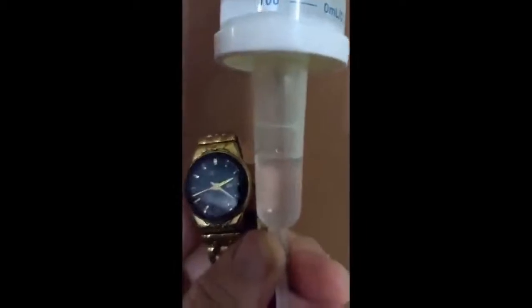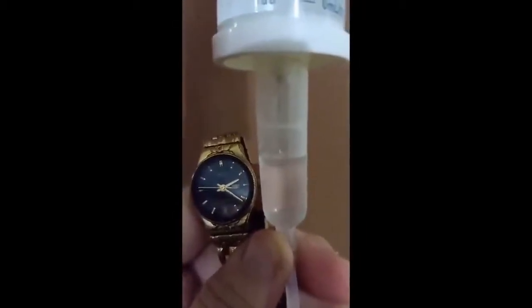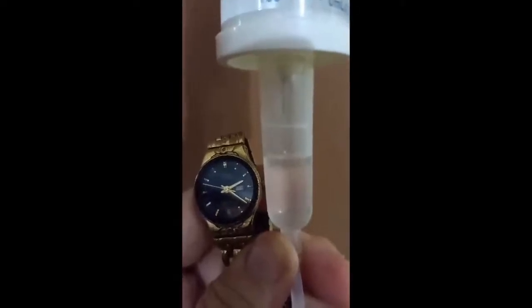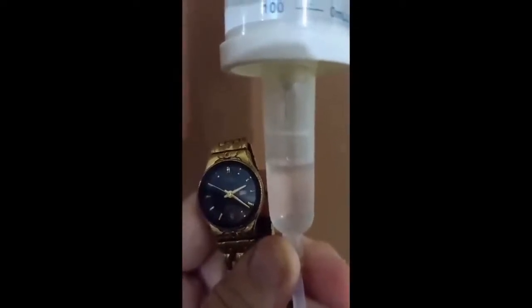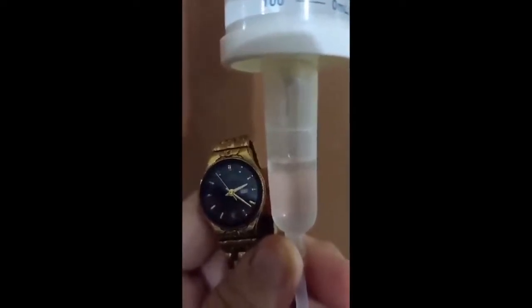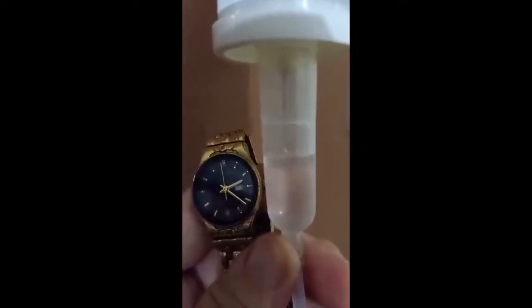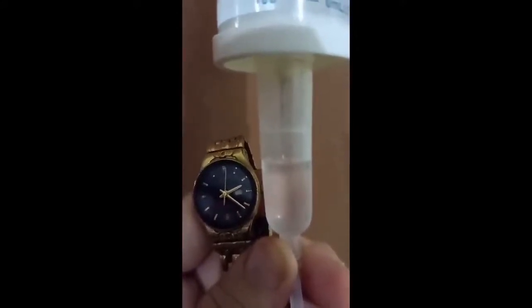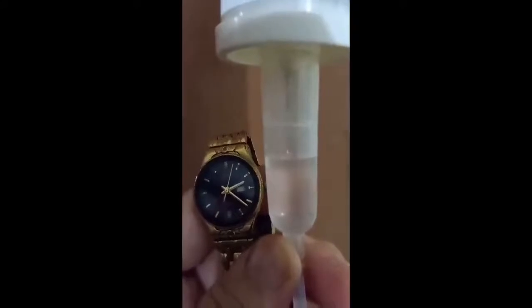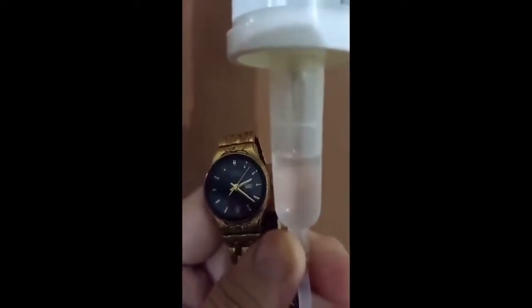Regulate the flow rate according to the order. For this one, 500 ml of IV fluid is given and it could be run for 8 hours. That means there will be 63 drops per minute. So we can regulate it by counting for one whole full minute.